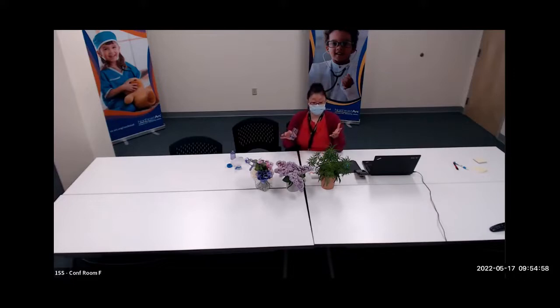The moment your patient takes the medication, they spray the medication into the AeroChamber. There is a risk that due to the static electricity created by rubbing the AeroChamber clean, you would, for example, pump the medication in, and then it would stick to the sides of the AeroChamber due to static instead of going into your lungs. So I just wanted to mention that.